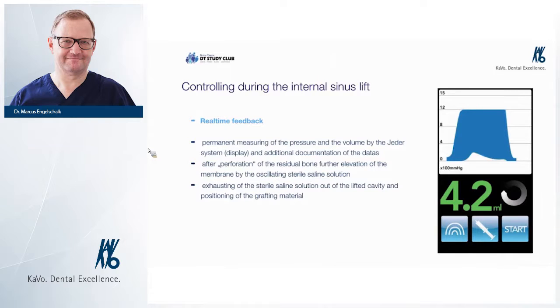There you have what I already mentioned. The technique successfully combines advantages of the lateral window approach, which permits the placement of high bone graft volumes, and the simplicity of the osteotome technique. This means it should be easy in your hand. It should be predictable and it should be successful. This is very important for the internal sinus floor elevation.